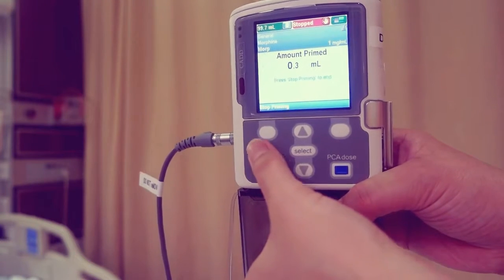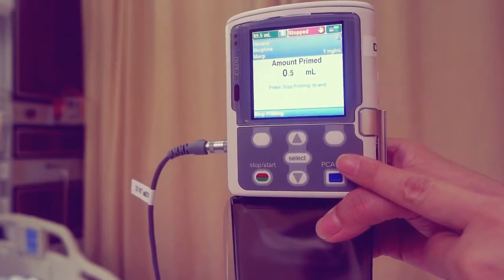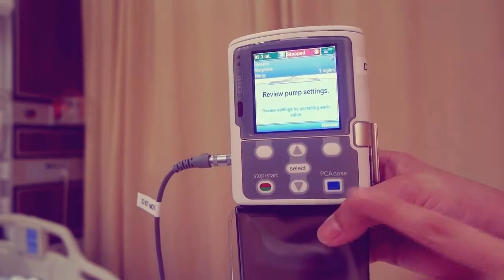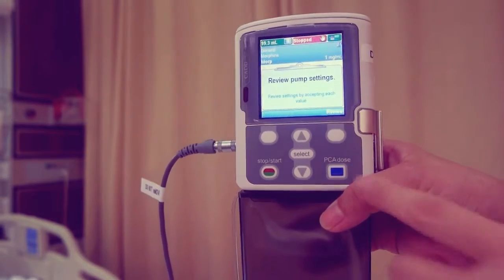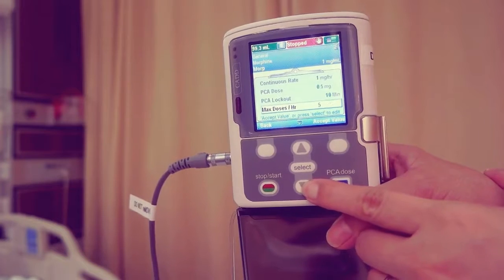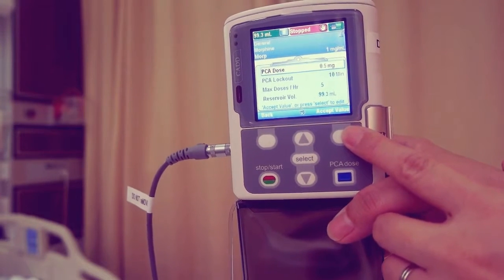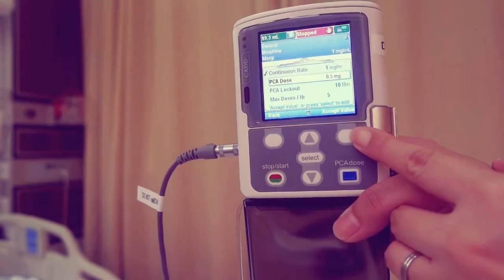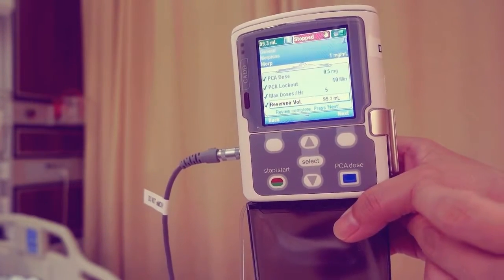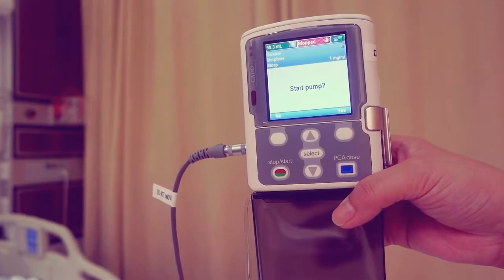Once priming is complete, press stop priming. Continue priming displays — press yes if priming is still required, or no if priming is complete. Then review pump settings displays. Press review. Choose accept value to confirm the value is correct for the highlighted patient's specific parameter, or press select to edit the highlighted parameter. Continue until all patient's specific parameters have been reviewed, accepted, and display checkmarks. Press next. Start pump displays. Press yes.